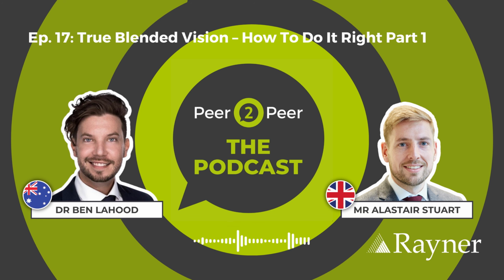Sure. So there's a lot of different terms for it out there. I think modified monovision is quite a good one. Blended vision is one that came from the Presbeyond Zeiss marketing from laser platforms. But essentially, it's to do with incorporating spherical aberration into the system. So the way that I'll explain it to patients is that monovision, as you suggested, is a method for treating presbyopia that stood the test of time. People have been using it for decades with contact lenses.